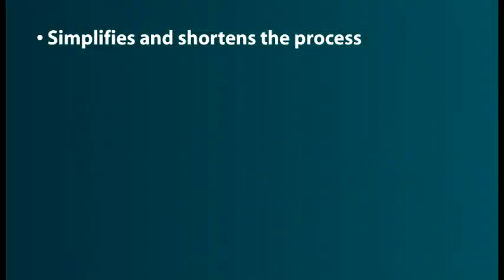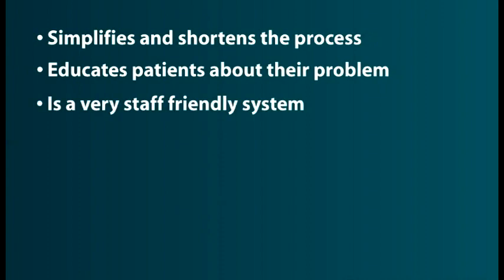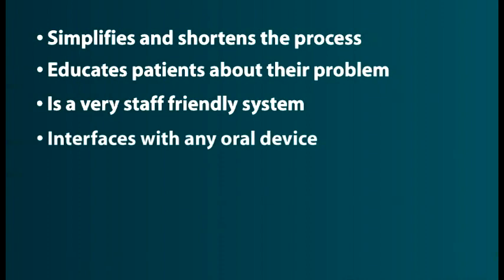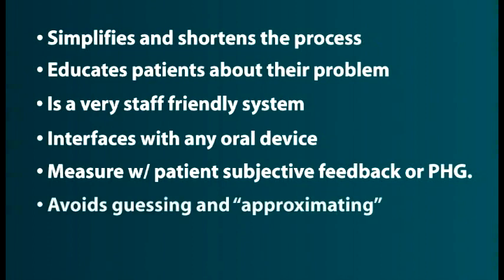In summary and conclusion, I'd like to review those things that can make your practice easier with this system. First of all, it simplifies and shortens the diagnostic process. It also educates patients about their problem and how you can help them. It is a very staff-friendly system. It interfaces with any oral device, and it measures with patient subjective feedback or with pharyngometry.